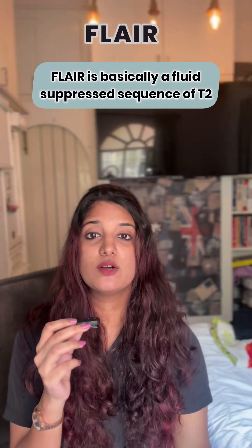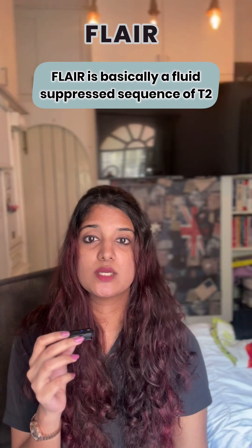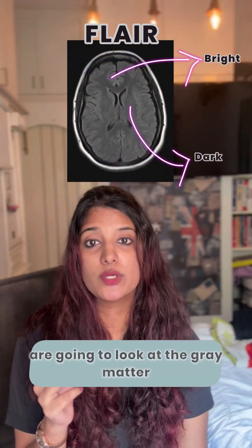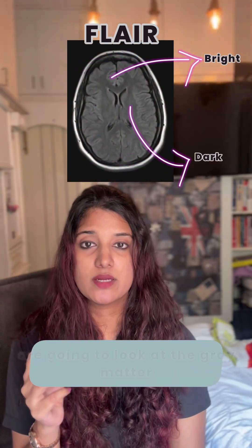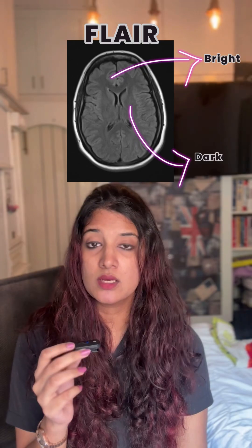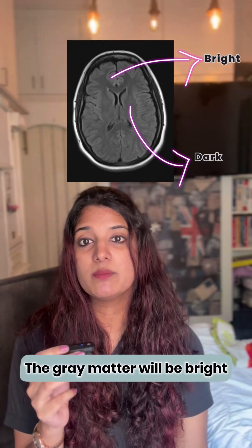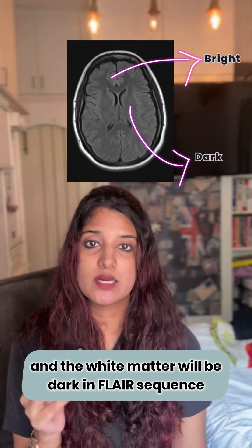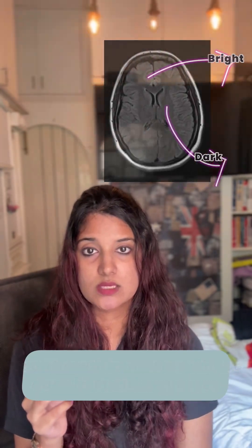FLAIR is basically a fluid-suppressed sequence of T2. In order to differentiate it from T1, you are going to look at the gray matter and the white matter. The gray matter will be bright and the white matter will be dark in the FLAIR sequence.